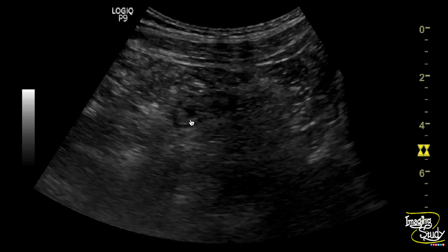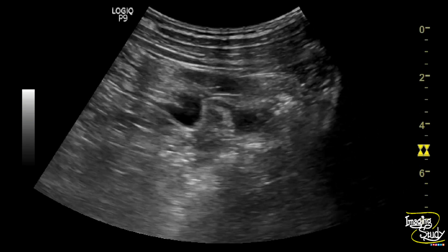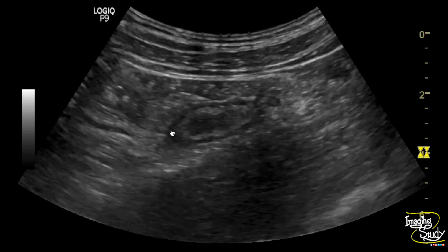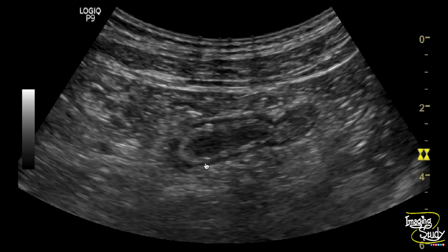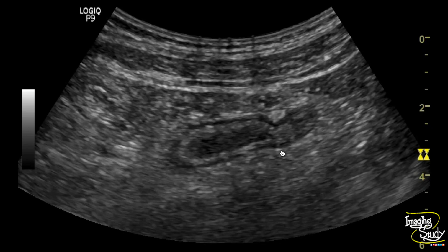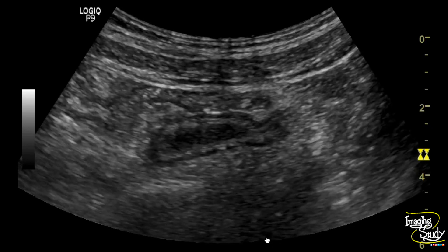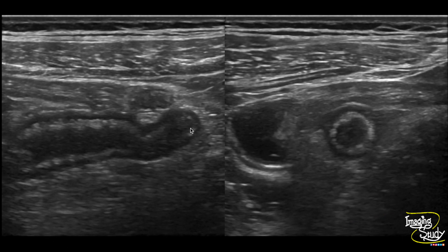Here you can see the curvilinear transducer view. You can see this blind-ended tubular appendix connected to adjacent cecum with surrounding fat stranding, well visualized. The appendix appears to be distended with surrounding fat stranding in both longitudinal and transverse sections.